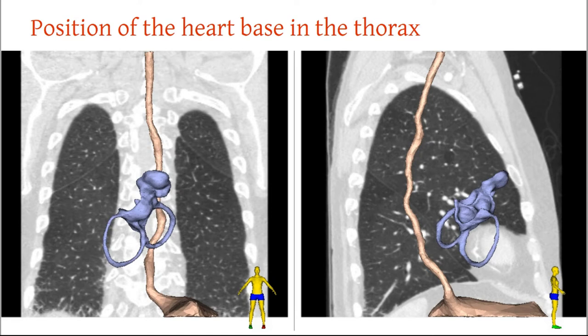So this part is very important, so make sure you get this part, because then the rest of it will be hard to follow without this. So again, picture the long axis of the aortic valve going from your right shoulder to the apex of your heart. And then once you have that, then it can rotate about that axis.